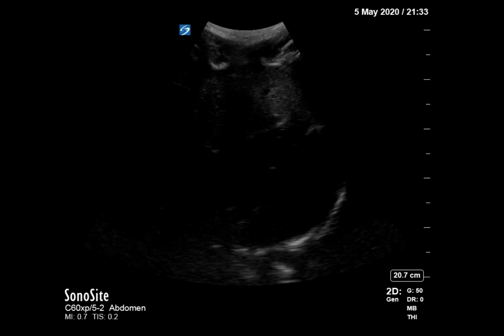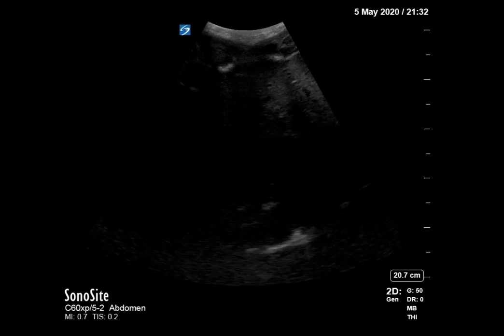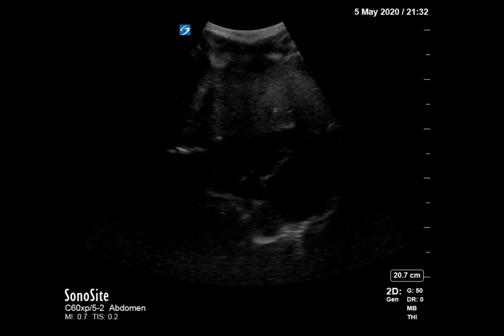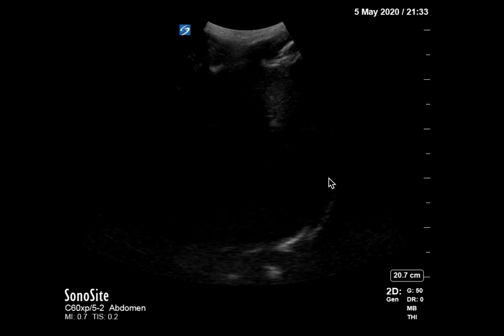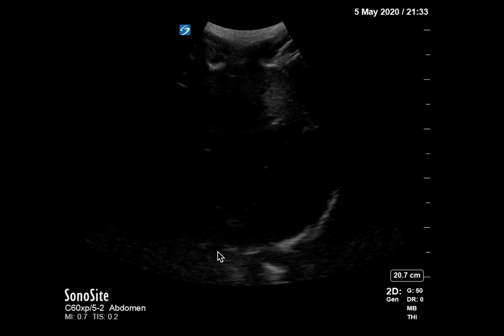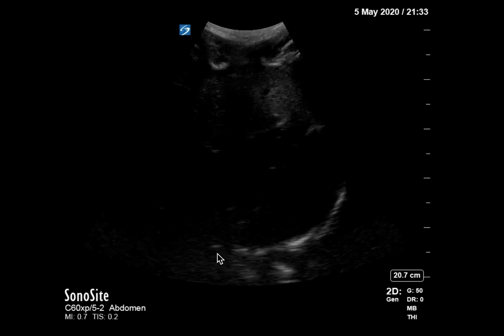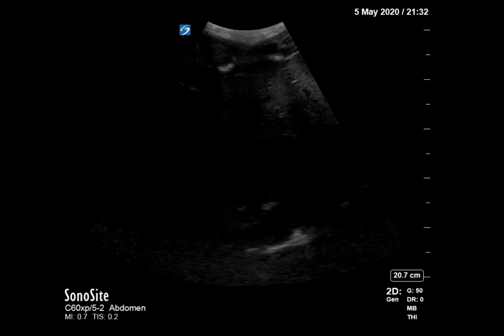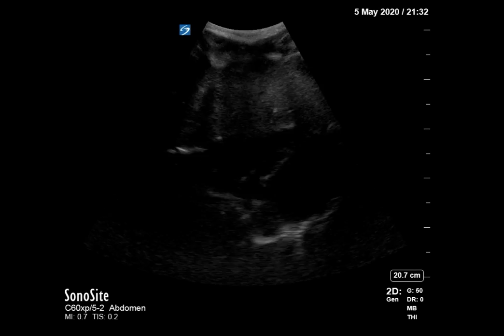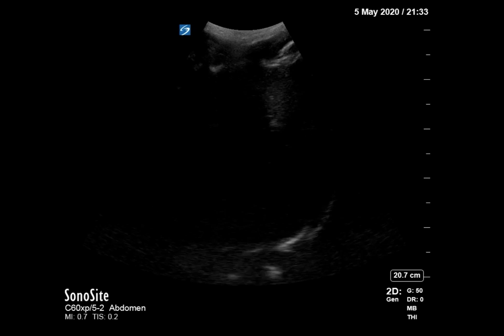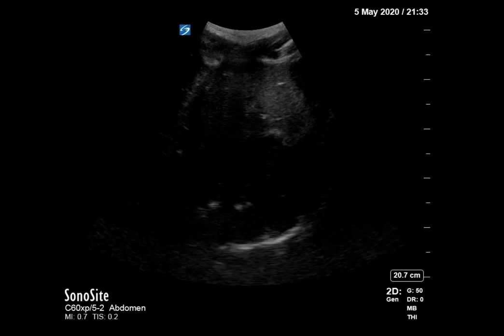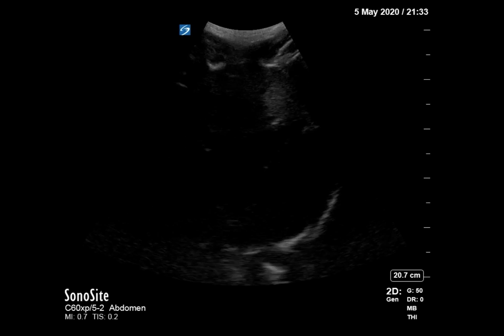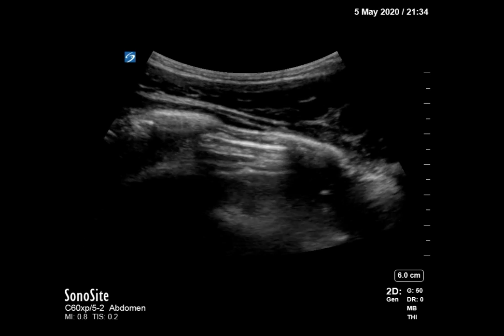We also took a quick view of the patient's heart. In the subxiphoid view here, you can make out the pericardium and there is no pericardial effusion. We got a pelvic view that is not included here, but that was also negative for free fluid.